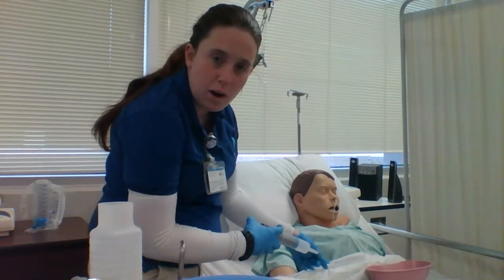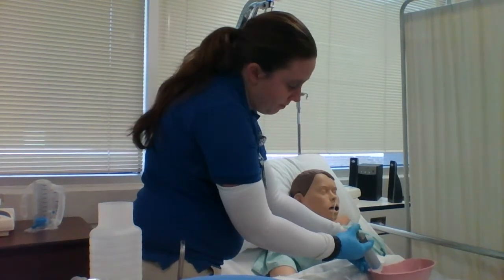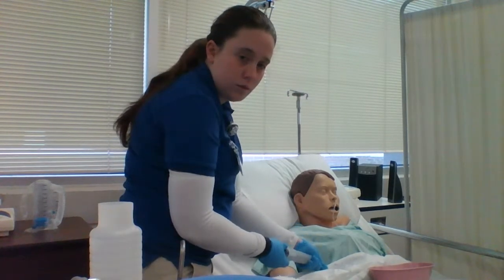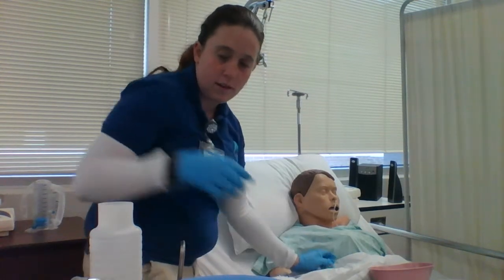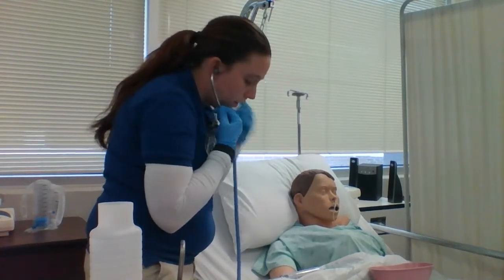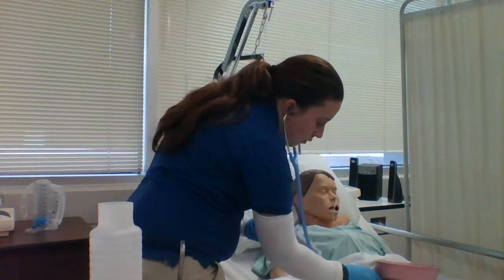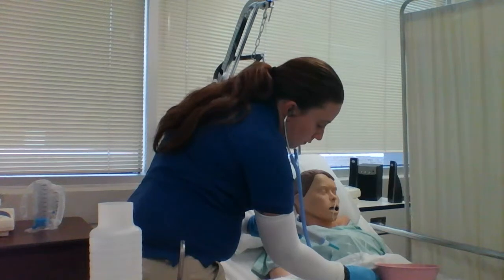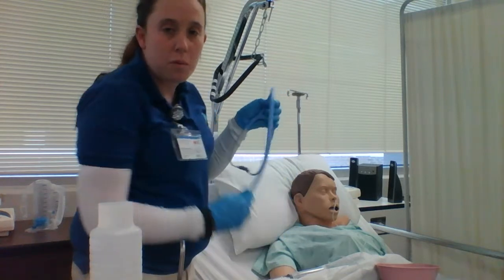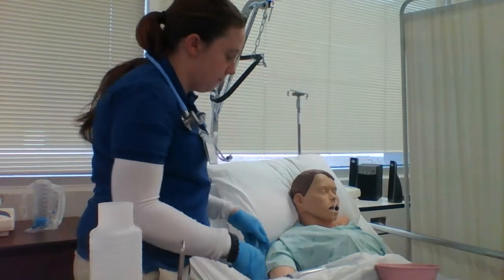Okay, and now I'm going to check the pH level on the pH strip, which I have right here. Okay. Alright, the pH level is 4, which is a good reading. Now I'm going to listen while I insufflate air. And a swishing sound was heard. But the golden rule for verification would be an X-ray, of course.